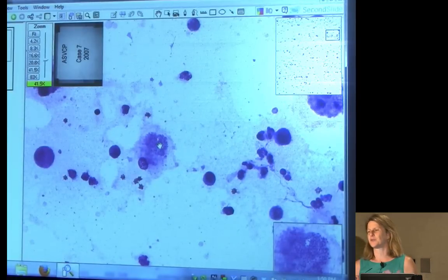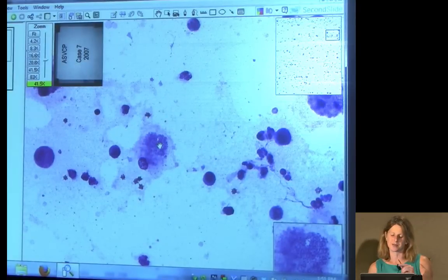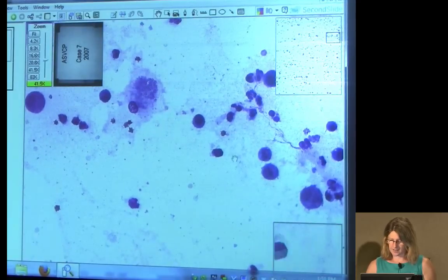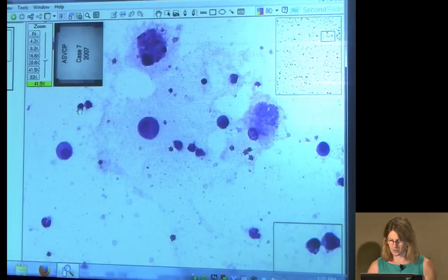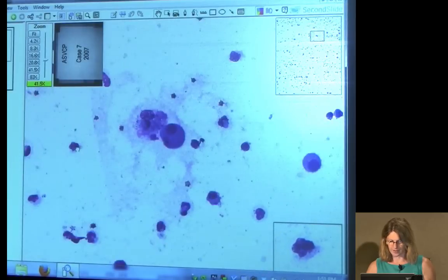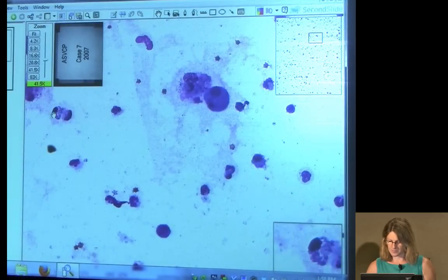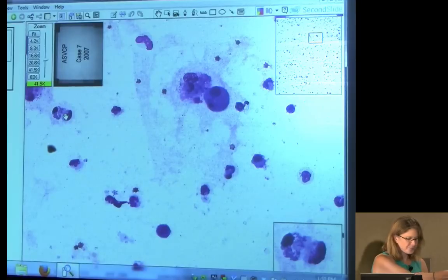The other thing I look for is uniformity. If it's very uniform and equal size, it's more likely to be an infectious agent or something real than if it's very variable chunks like you've seen in all the stain precipitate there. So these look like coccoid bacteria, right? But they're in a macrophage. If you look around, there are actually some within a neutrophil, so this is an unhappy neutrophil next to a lymphocyte, but there are a couple in a neutrophil that you really have to hunt for. There's a neutrophil jam-packed with them, and there's another neutrophil right next to it with the bacteria right in there. You can kind of see it just over there.